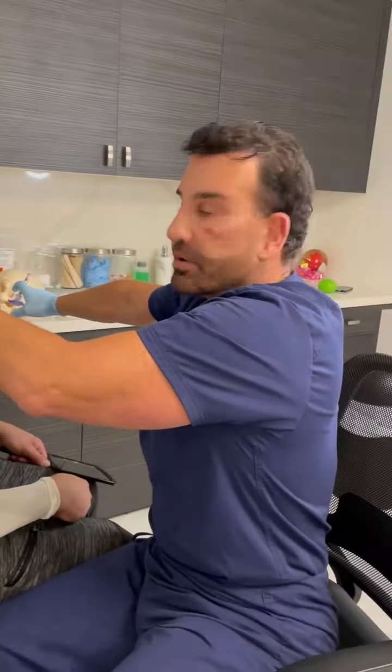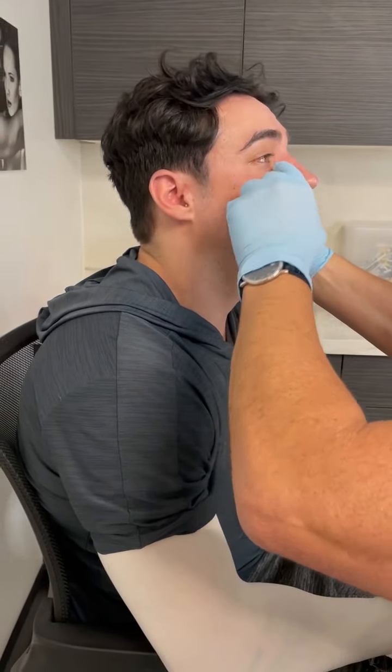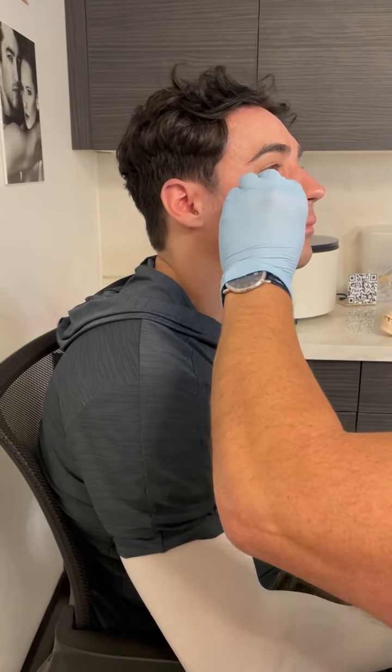You can see how it mirrors the natural bony arch of the skull, and you can see how now he has a perfect three-point promontory, a perfect upside down triangle of beauty. The other thing is that the anterior posterior projection of the zygoma is now in front of the plane of the orbit. Before we started, the cheek was as flat as his eye, but hold that, stop the bleeding. But what you want is the zygomatic arch in front of the eyeball, not the same plane as the eyeball, so that in the lateral view, the zygoma or the cheek projects in front of the eyeball, and in the frontal view, that creates that three-point promontory, prominence, prominence, prominence.